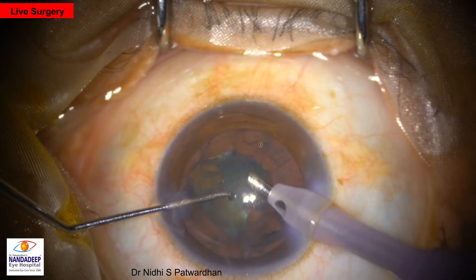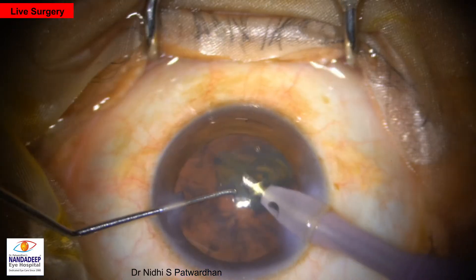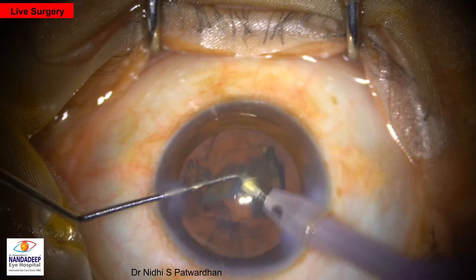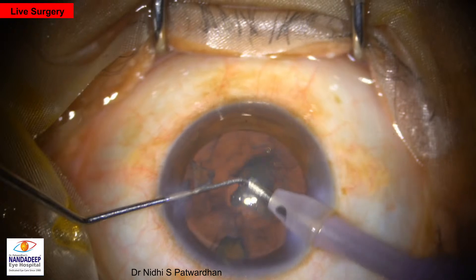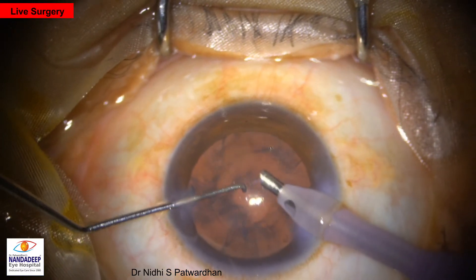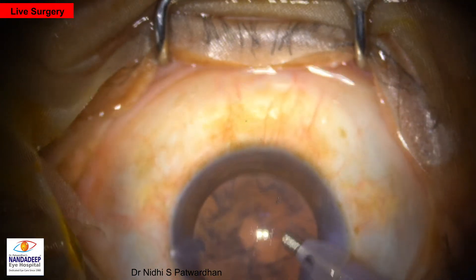Minimal phaco energy is being used here. The phaco is in continuous Ozil mode and the power is being calibrated using the foot switch. Now this is the last piece, so we have to watch for any posterior capsule fluctuations. The anterior chamber appears well solid, so no need to change any parameters. That is the end of phaco.